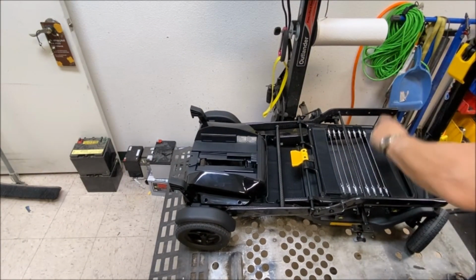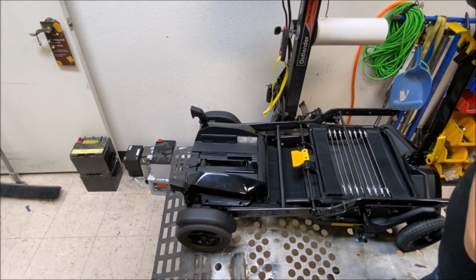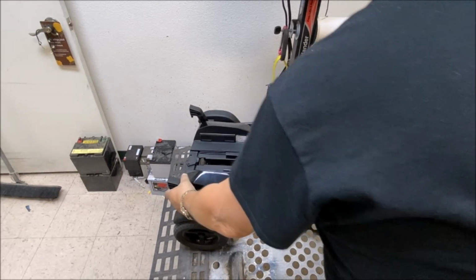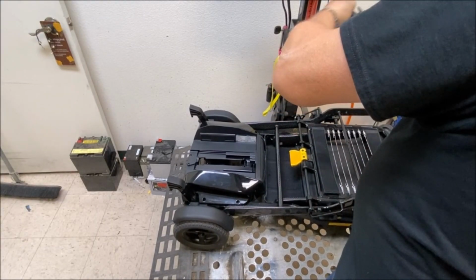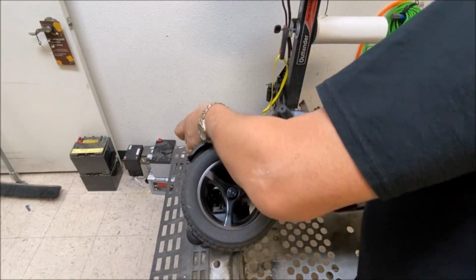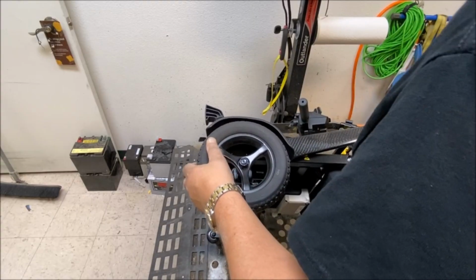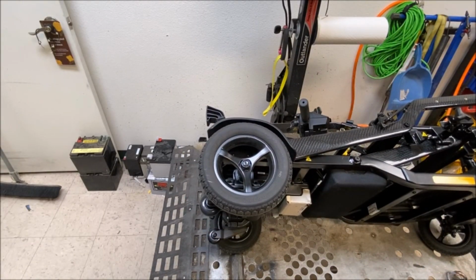Alright. Don't need the back on there. Remove that. Bit on each side. Okay. Yeah, I can see the screws there. 1, 2, 3. It looks like 3 screws behind the wheel. And it's going to be a 3/4 to remove the wheel.